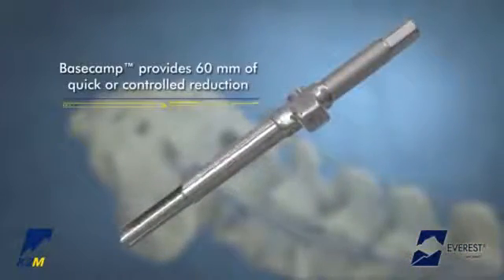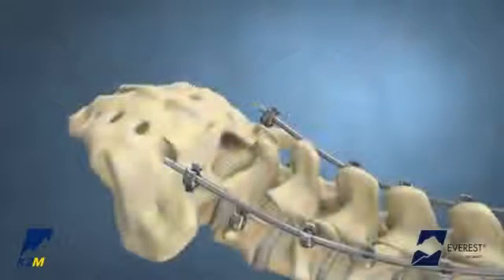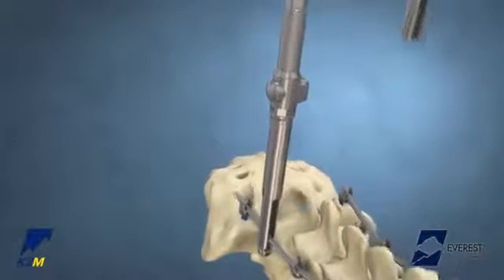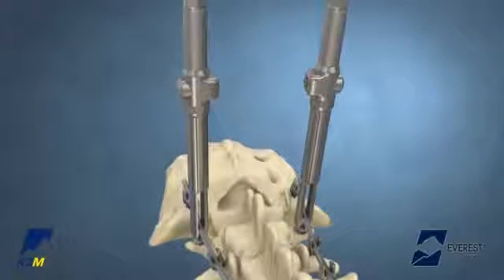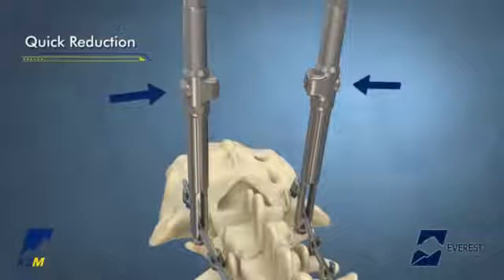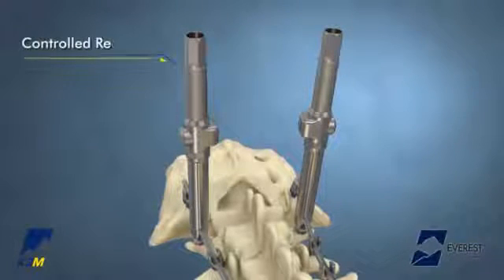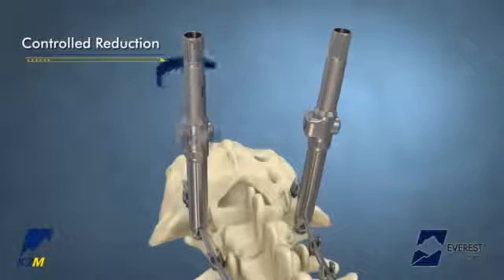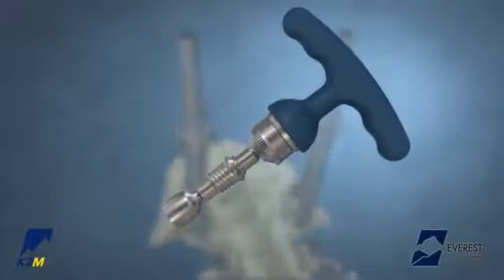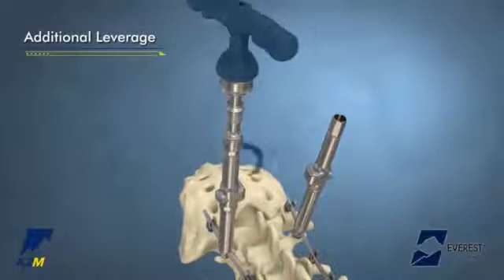For reductions up to 60 mm into Everest screws, the Everest Base Camp Tubes may be used. The Base Camp Tubes can be attached to the screw head by applying an axial downward force. Multiple Base Camp Tubes may be used on adjacent segments to facilitate correction. For quick reduction, press the release button on the Base Camp Tube and slide it down to meet the rod. If gradual or more powerful reduction is desired, rotate the proximal end of the Base Camp Tube in a clockwise direction. If additional torque or a ratchet mechanism is needed, a T-handle can be connected to the proximal end of the tube using a quick-connect hex chuck.